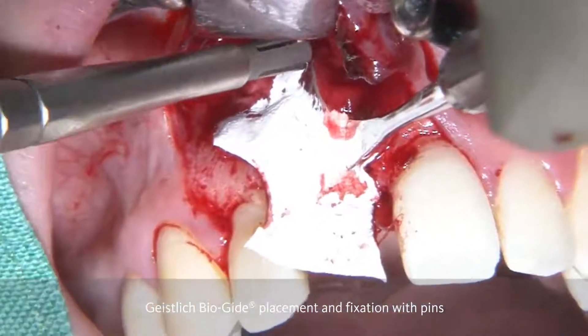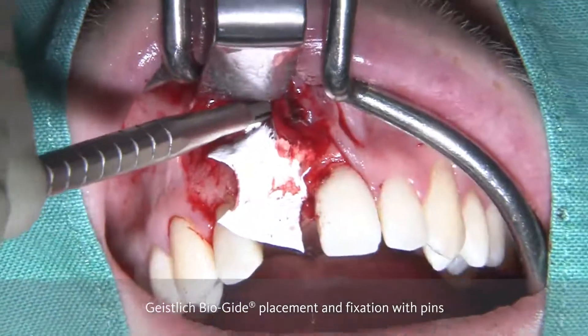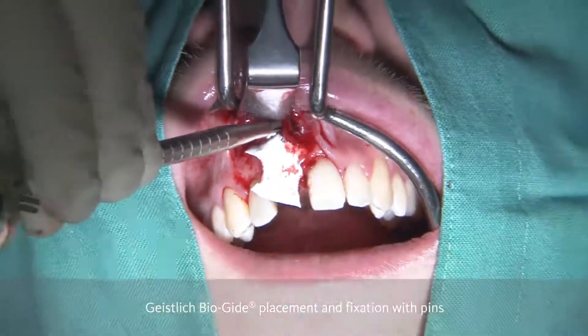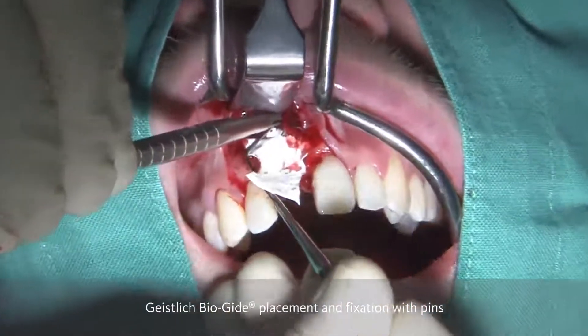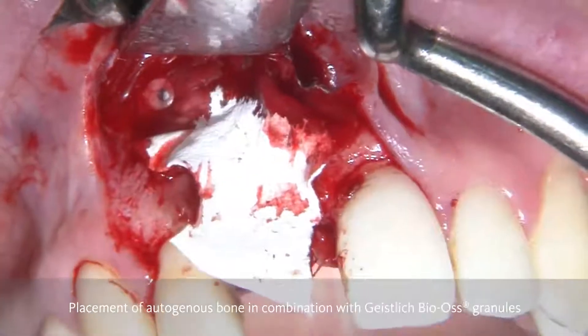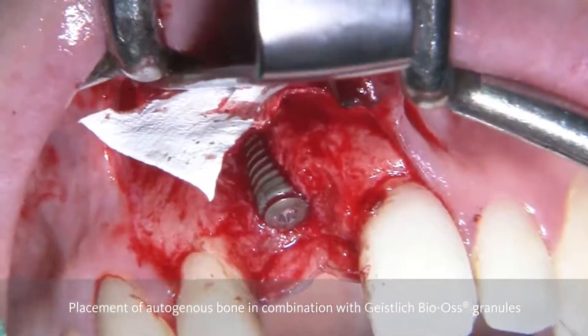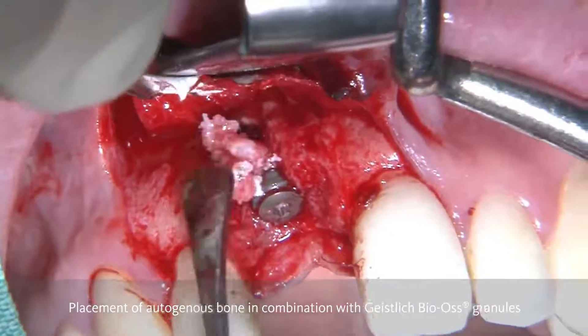In order to facilitate this process, we do multiple holes so that it is easier to find the pins. You can see here, with the pin holder and the slide hammer, we can get the pins into position. This procedure is of utmost importance in order to stabilize the membrane, but also the graft material later on.